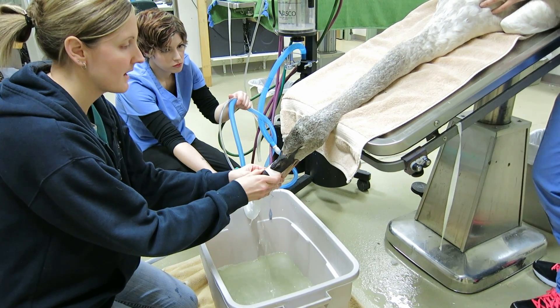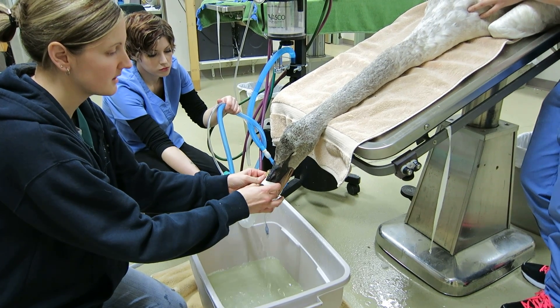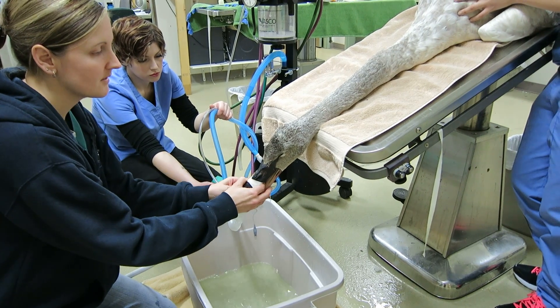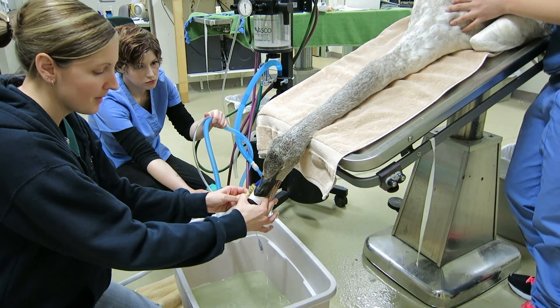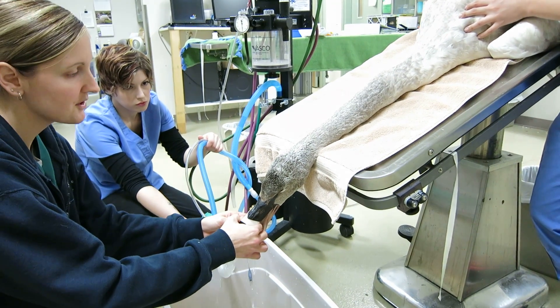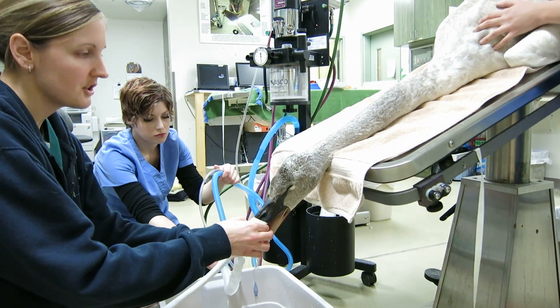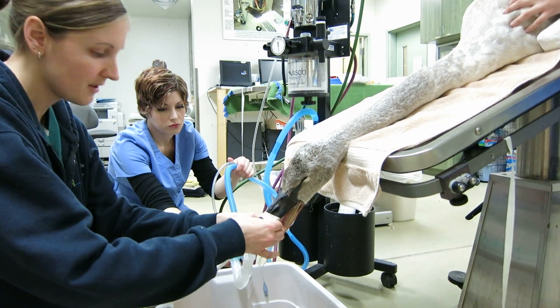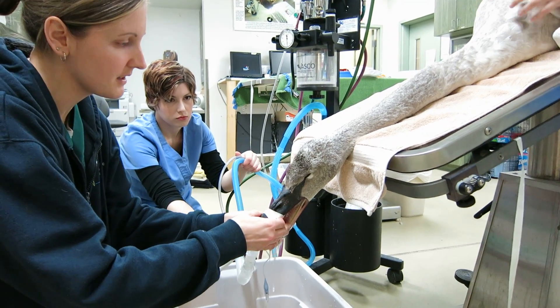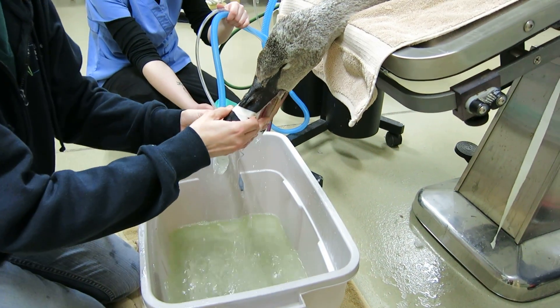Once we get a bunch of debris out of his stomach, we can sift through the bottom and see if it looks like we got the lead pieces. Luckily they were large pieces, which makes it a little easier to identify them. Sometimes swans come in with tiny pieces of lead about the size of the tip of a pencil, and there will be several of them, so it's hard to say if you got them all. We'll take another radiograph in a few minutes to see if those lead pieces are still present or not — but it looks like we're getting some good chunks here, so I think we're successful at getting some, if not all, of the lead pieces out.